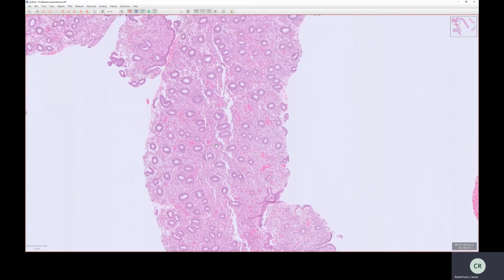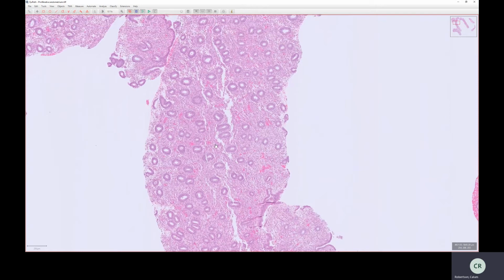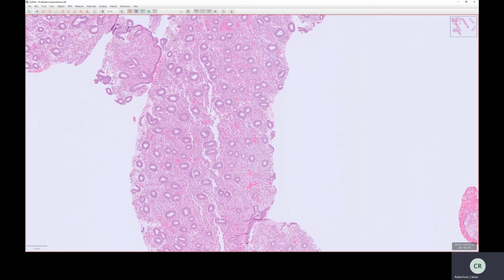That's really the main reason usually they take biopsies of the endometrium: to look out for hyperplasia or atypical hyperplasia, and that is because hyperplasia is a precursor or risk factor to endometrial adenocarcinoma. So there's a well-described pathway that goes from normal endometrium to endometrial hyperplasia to atypical hyperplasia to endometrial carcinoma. And so we're looking for those precursors to catch those before patients have developed endometrial carcinoma. So we always look out for that.